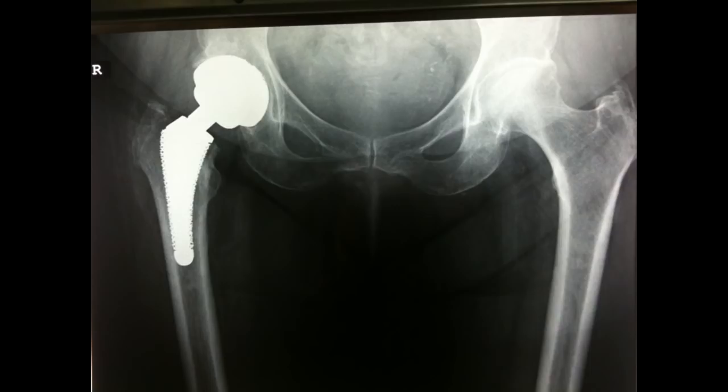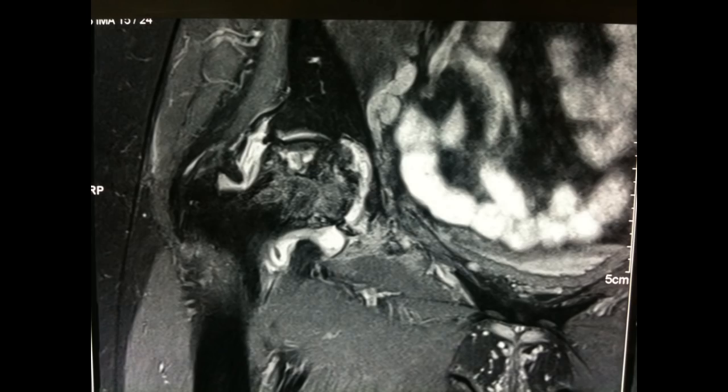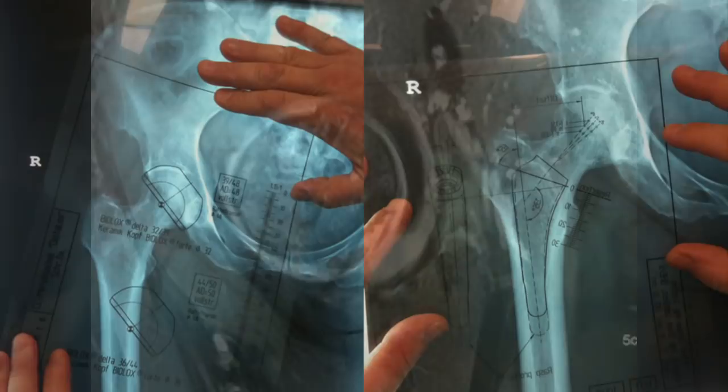A total hip replacement is a procedure that involves significant planning and preparation. The patient presents to theater with hardcopy films of their radiographs, and the orthopedic surgeon will template the potential implants that are going to be used.